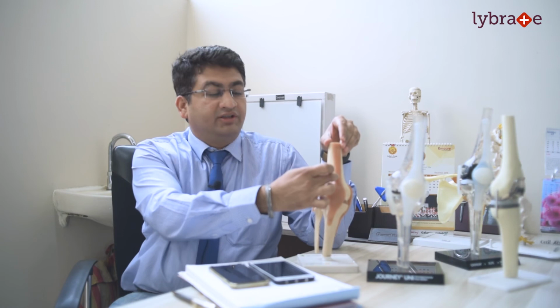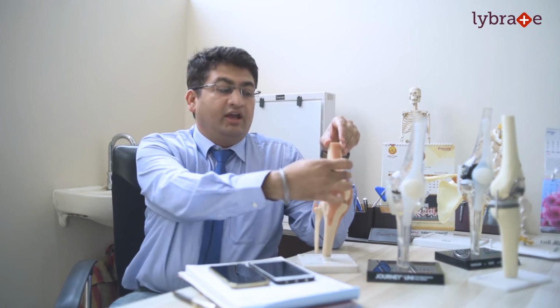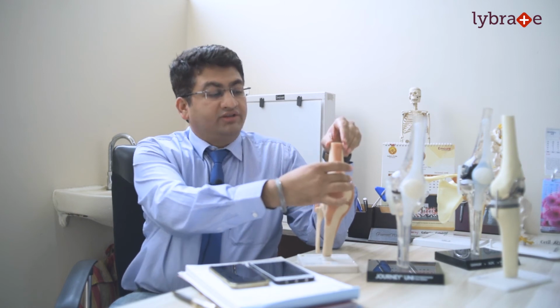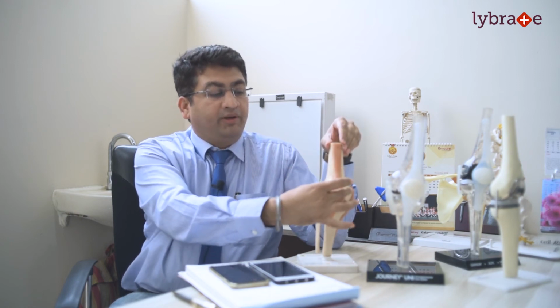For this, I am using a different approach for the surgery, which I call the subvastus approach, where I am not cutting the vastus muscle which is giving strength to the knee joint in the functioning of the knee joint. I am just going beneath the muscle, retracting the patella and then down to the knee joint and doing the surgery. Once I am done with the surgery, I put back the quadriceps or the vastus muscle in position.